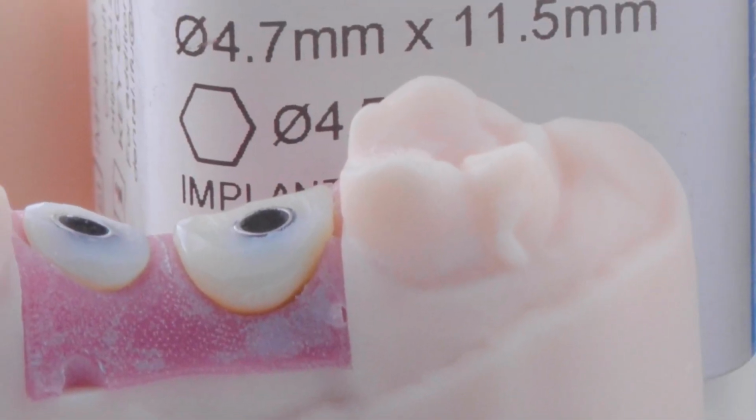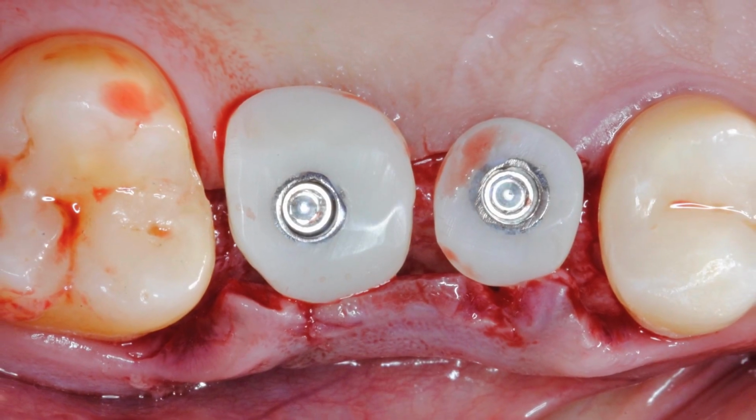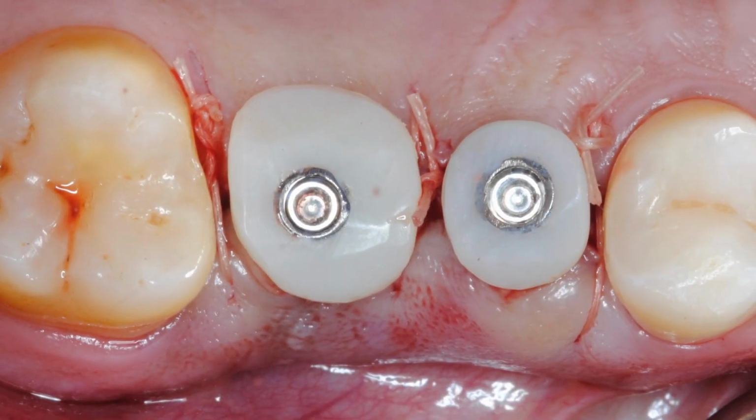Now, you can also do what we call a customized healing abutment. The benefit of the customized healing abutment compared to just a stock healing abutment is that now you're going to have the ideal emergence profile for your implant, starting to work on that the day of implant placement. So right after the implant is placed, you insert this customized healing abutment, and you suture around the customized healing abutment. Again, this is going to now allow the tissue to heal in that ideal shape and form based on the tooth that you're trying to restore.